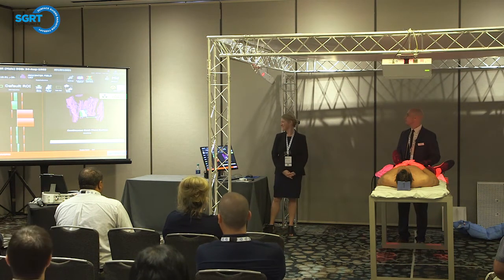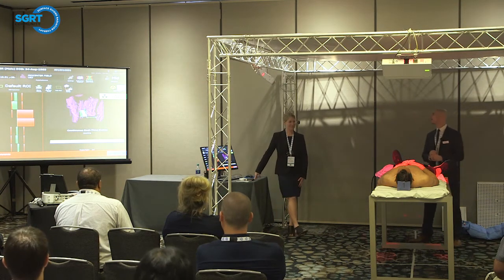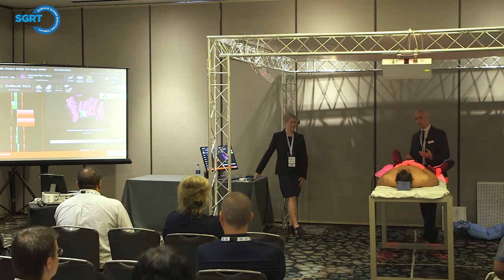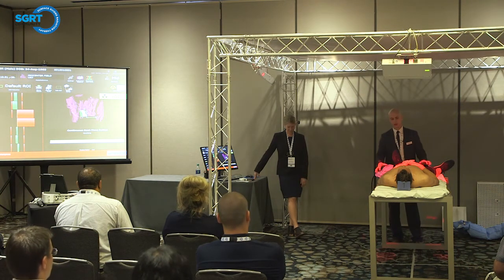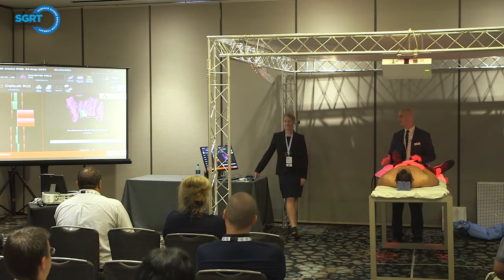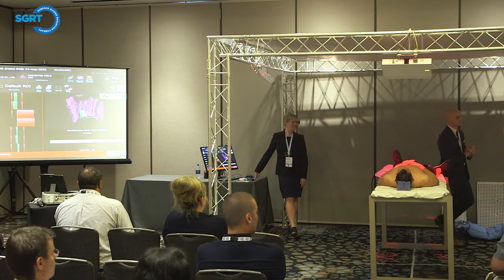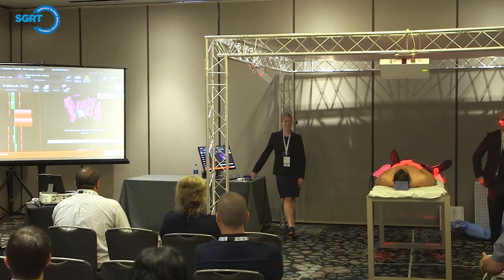But, okay, so that's what we want to do. So try and get everything less than 1. I tried to get it less than 0.5. I could probably tweak this a little bit more and spend a little bit more time getting that going. But everything less than 1, I want to see if you guys can beat me. So we have, how many seconds again? 32.4, okay.